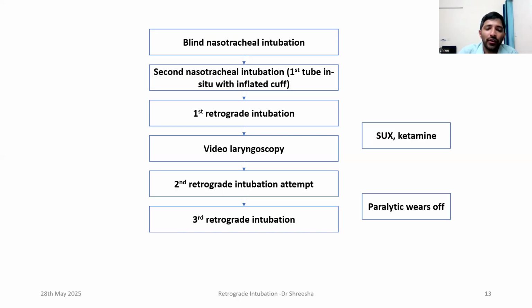And we waited for about 5 to 10 minutes for the succinylcholine to wear off, and we started bagging the patient in the meantime. And once the patient started having spontaneous respiration, we gave a third attempt at retrograde intubation, and this was successful.